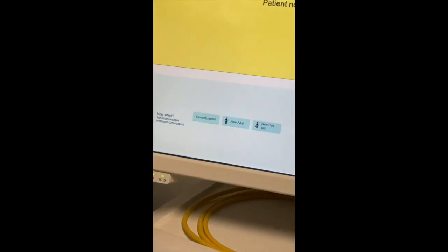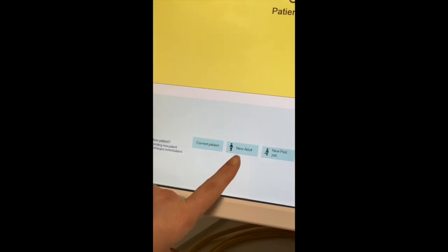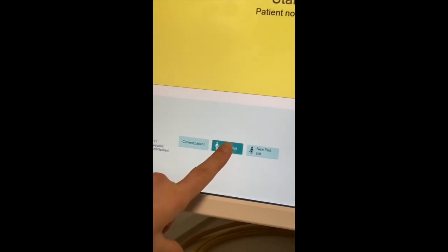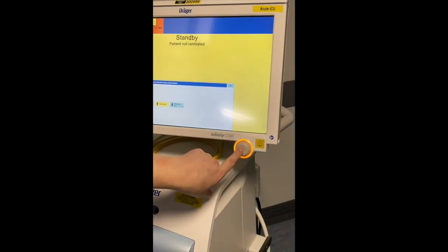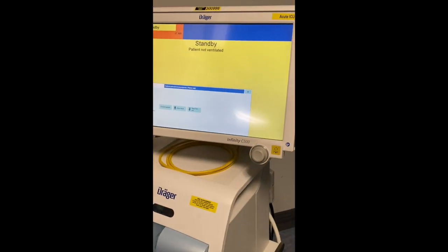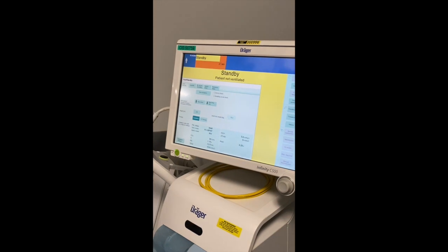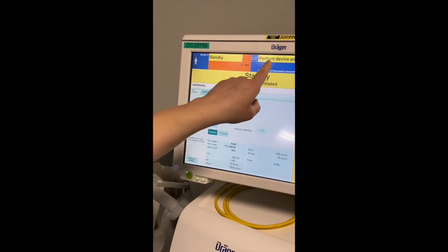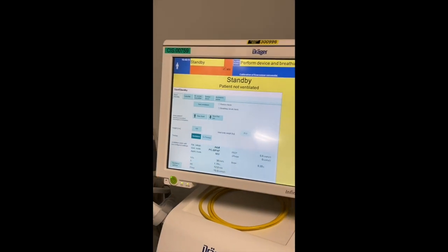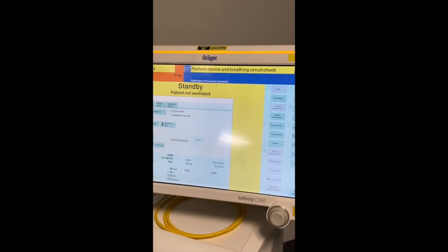When you get the standby screen, press New Adult for a new patient. Confirm it with the rotary knob, otherwise it won't move forward. You get into the standby device screen. The first thing you need to do is perform a device and breathing circuit check — it won't let you progress until you perform this check.